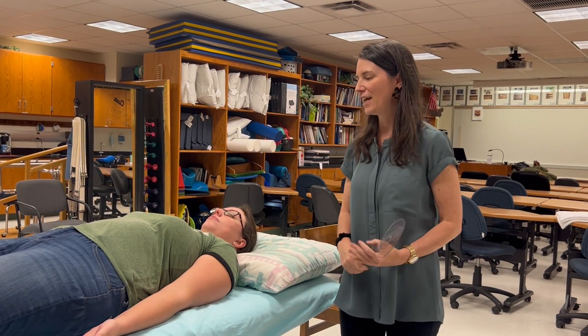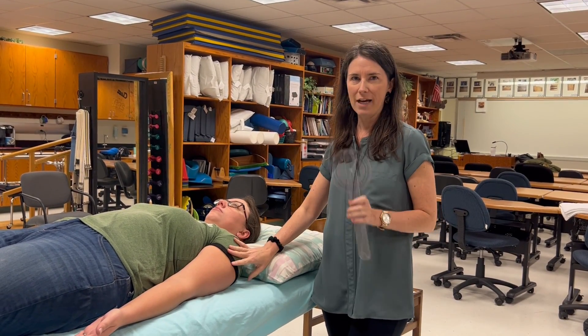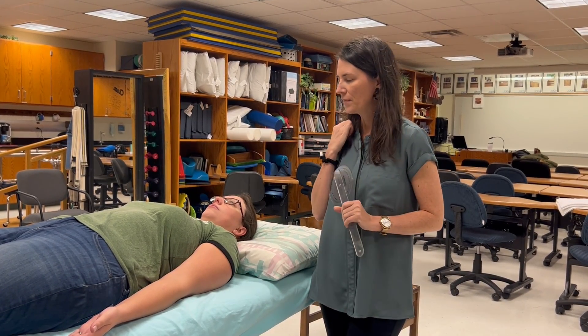In this video, we're going to start with goniometry for shoulder abduction.